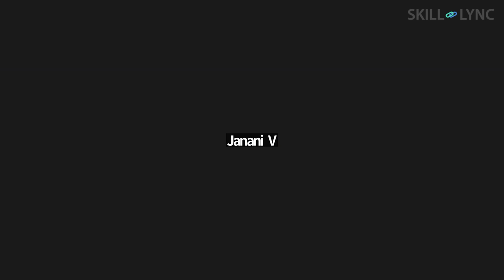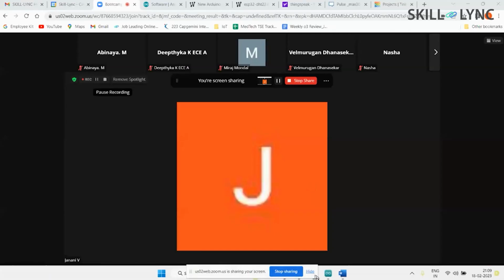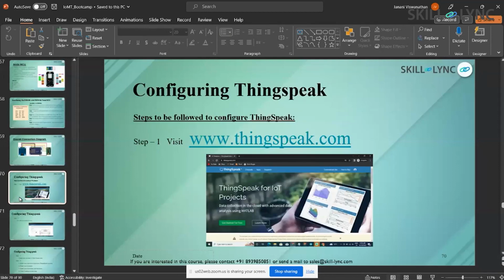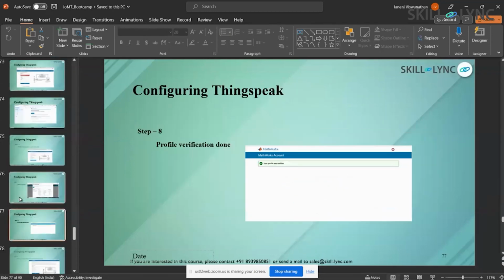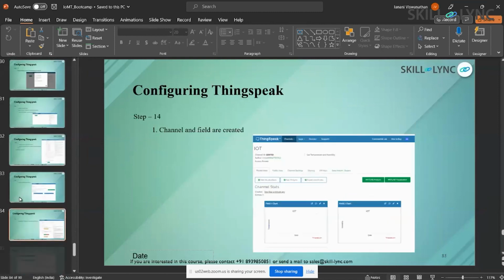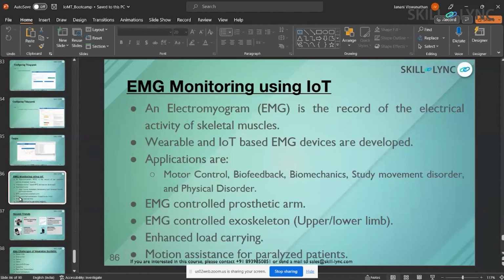But this is how, generally, people who are going to kickstart with Internet of Things for healthcare will start. So the first thing we have to consider is the reliability of the sensors. Things like Arduino and these sensors, the reliability is very low, guys. Just for an entry level and for the connection level, you can start working with it. And as I told you, each sensor will be less than $200, and you can monitor with it.